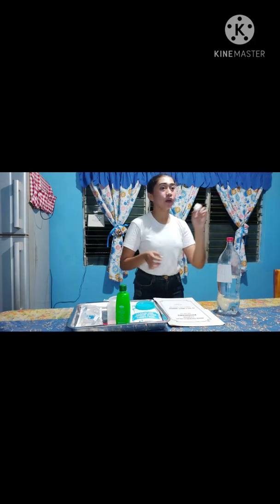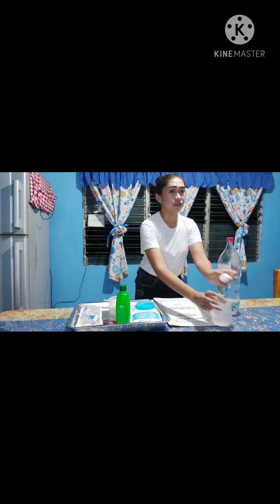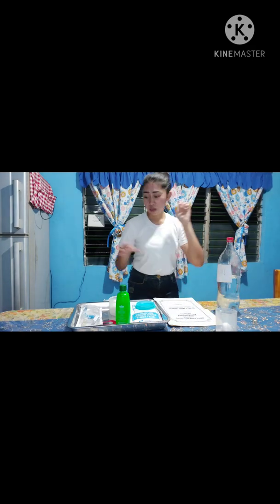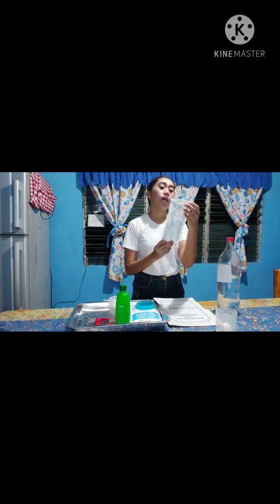And then we're going to take out the IV set from the package. So this is the IV set, and then we're going to take it out from its package. The first thing we need to do is check its expiry date. This one expires in 2023, so it's good. And then make sure it is completely sealed. So it's still good.